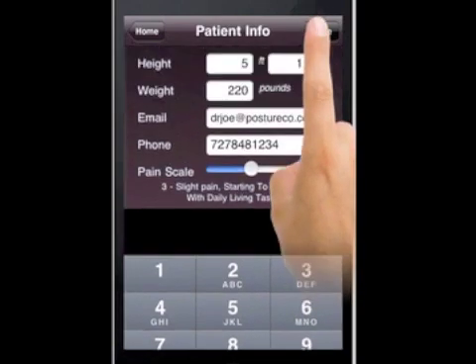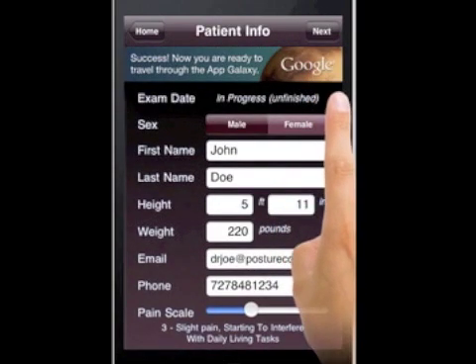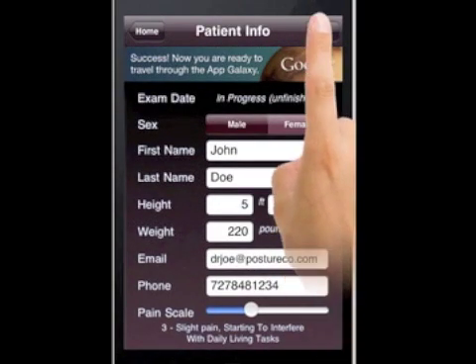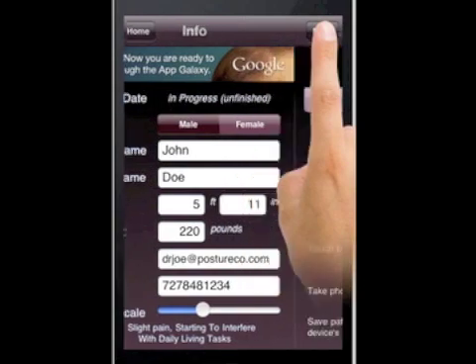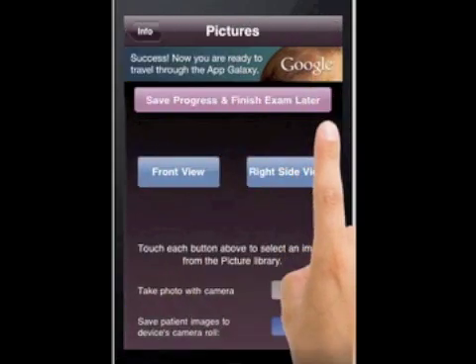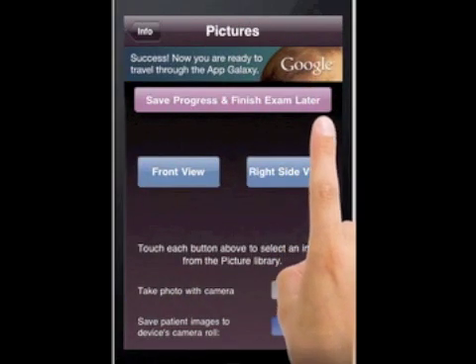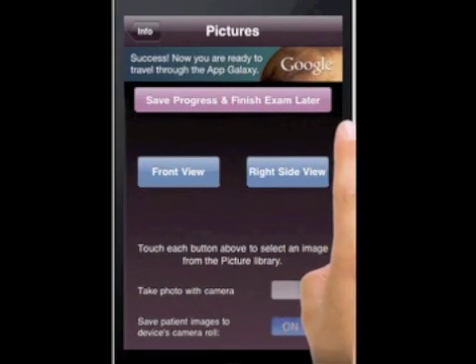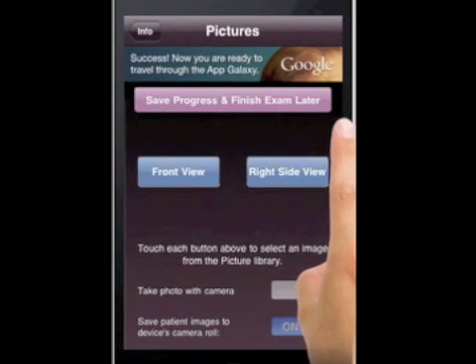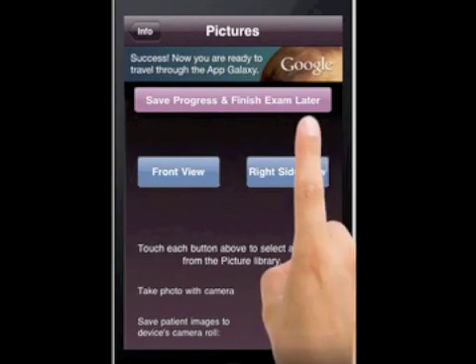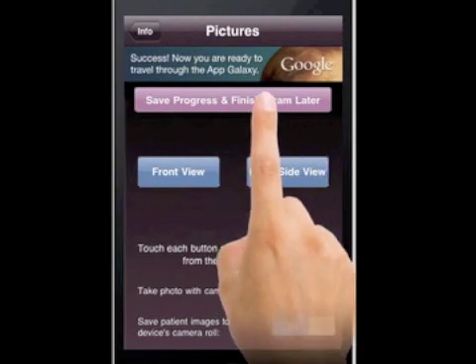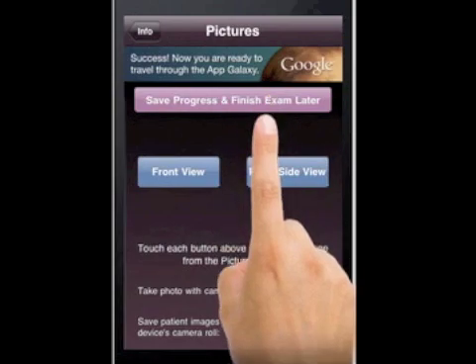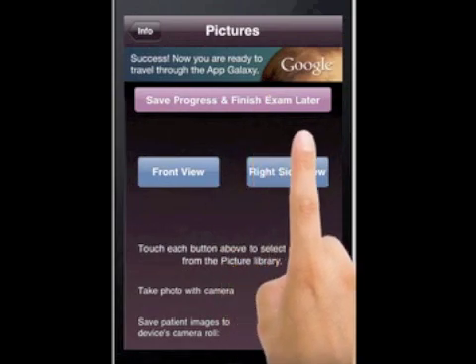We're going to hit Done. At this point you just hit Next. If you had a bunch of people coming in for a health talk in your office and you knew their names, you could set them up in advance, then hit Save and finish the exam later.